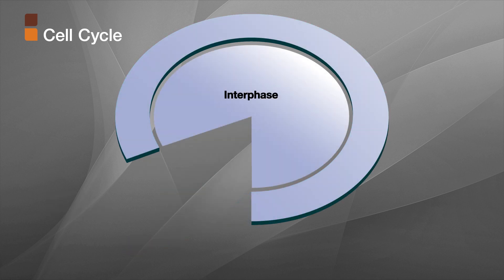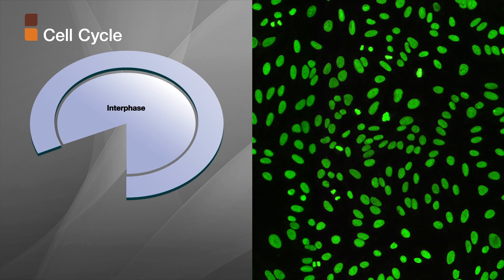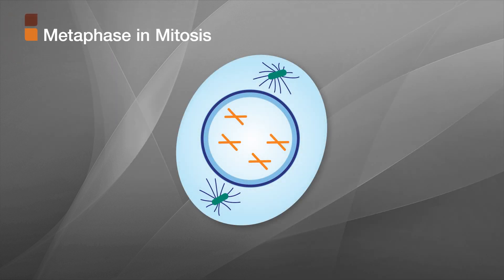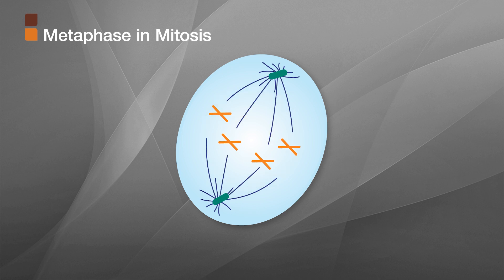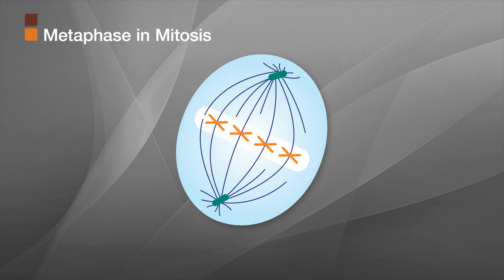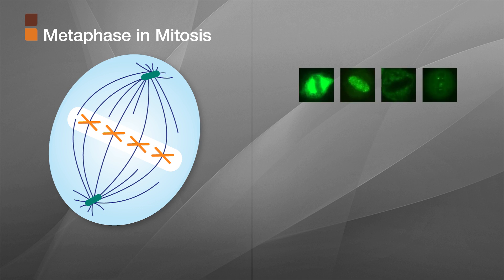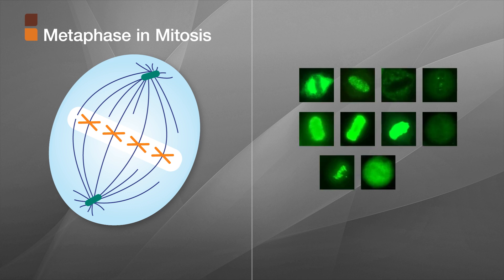Interphase is often called the resting phase — it's the time between cell birth and when the cell divides again. Most of the cells that you see on the slide are interphase cells, and most autoantibodies are directed against cells in interphase. Metaphase is the part of mitosis where the chromatin is highly condensed and aligned in the center of the cell. Cells at metaphase are ideal for dividing cell pattern identification because they have a distinctive appearance that is easy to recognize.